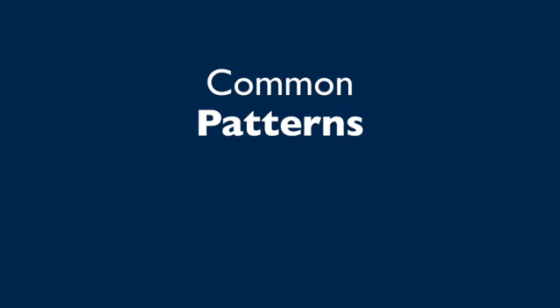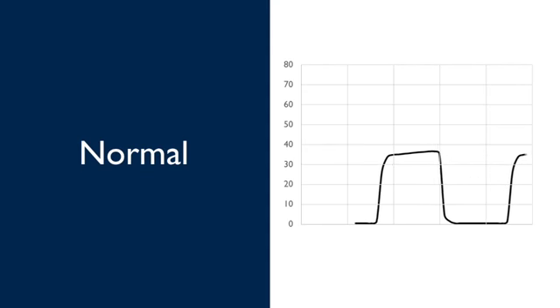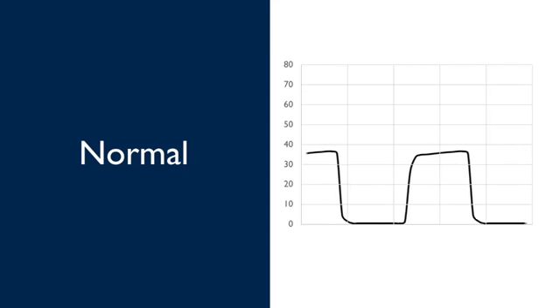Alright, now that we have some physiology under our belts, let's take a look at some common patterns that we're going to run into in the ICU. This one you may recognize. This is a normal capnogram, but let's review it for a little bit.